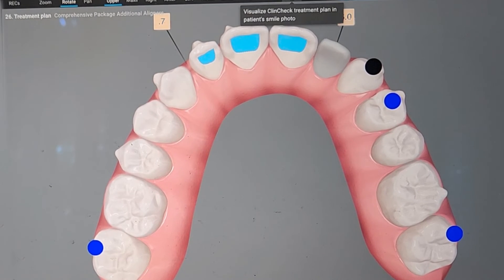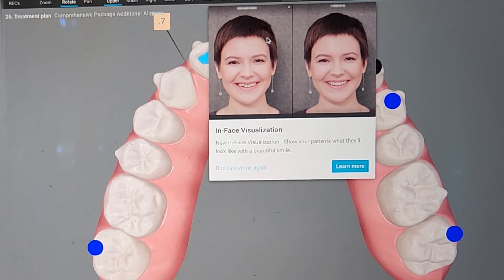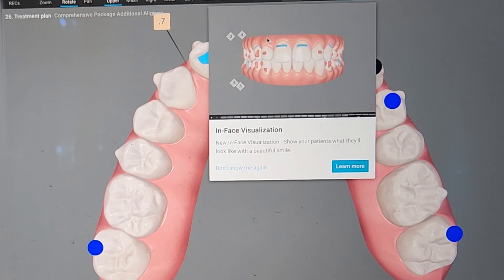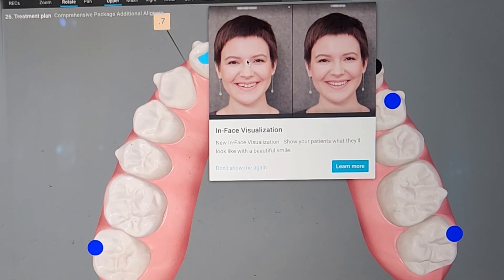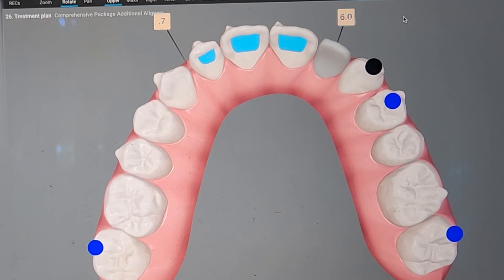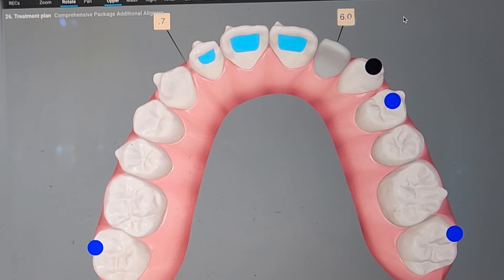The smile button — I'm not going to push it right now because I don't have permission to show the photos, just the ClinCheck. But it will show you the patient's face. If you use the photo upload in the practice app and you're using an iTero scanner, you'll be able to see the patient's midline in real time. That is very, very powerful. As well as Smile Architect if you've enabled it — it's a great way to see what restorative work looks like.